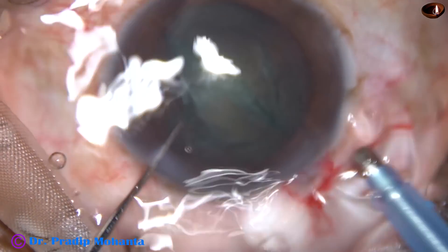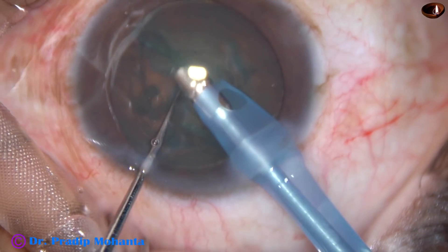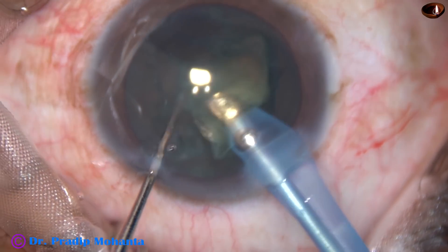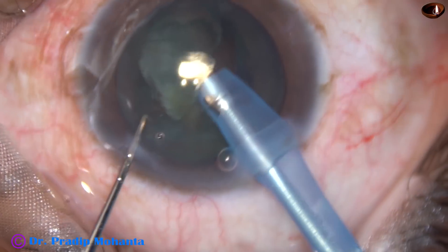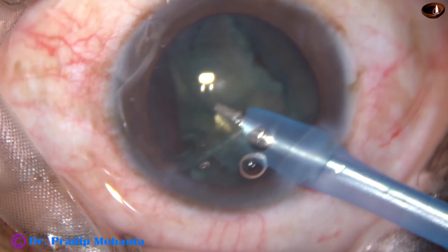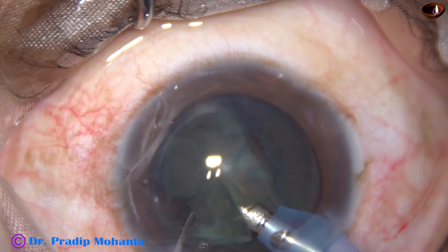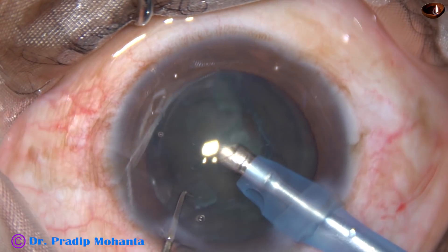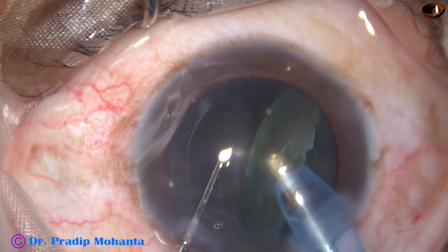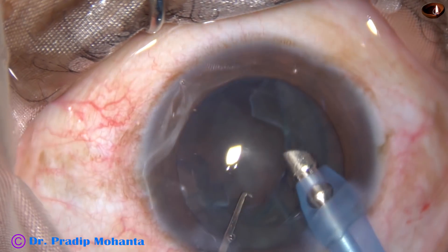Now I introduce the tip of the FACO handpiece, bevel down, and remove some cortical matter. I turn the tip towards the right side and the right hemi-nucleus tumbles and comes to the tip. Then I turn the tip towards the other hemi-nucleus and it is removed in no time.